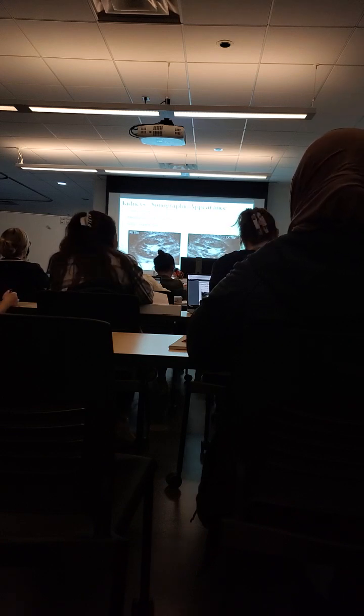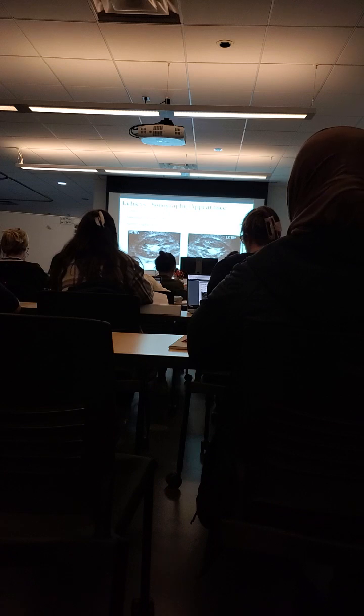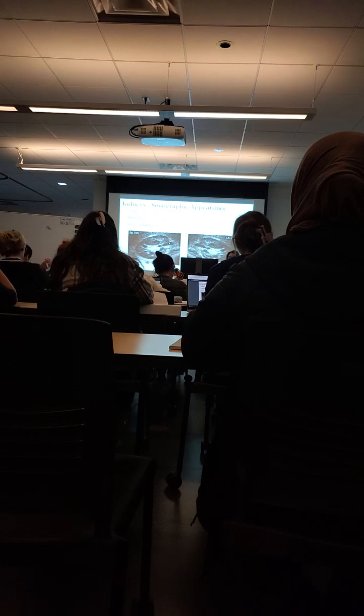Okay, so here's what it looks like transverse. This is transverse, mid. How do I know that it's mid? Anybody? I mean, this is a wild guess. You may not know, and that's okay. Because you've got, this is actually a vessel right here. This is one of the main vessels. And that's how you know you're at mid. Mid and medial will have the vessels. We'll talk about that again on that page when we get there.